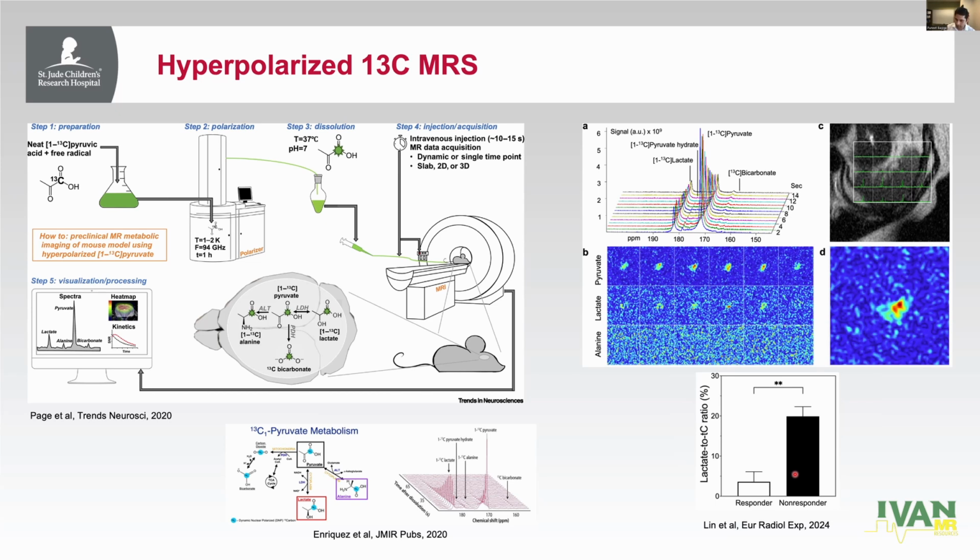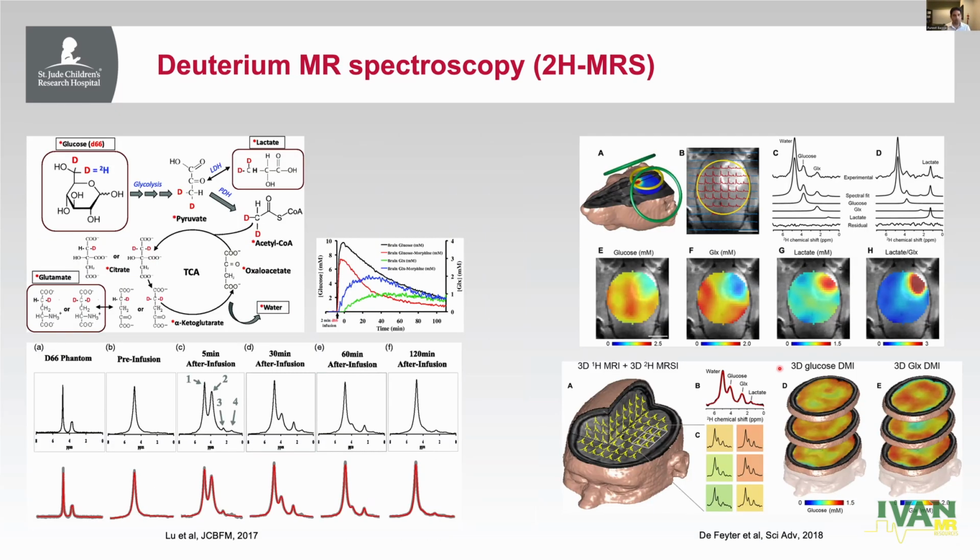And we all know glycolysis is the primary metabolic pathway that the tumors take, among many other things. But it's a very neat study showing that tumors with high glycolysis have poor prognosis for radiation response, so to speak.